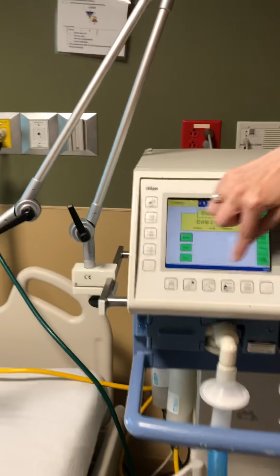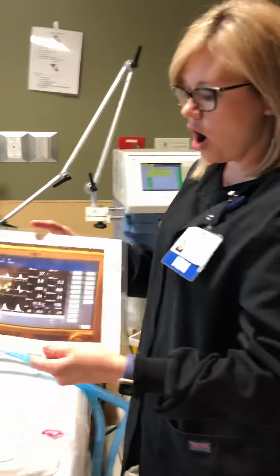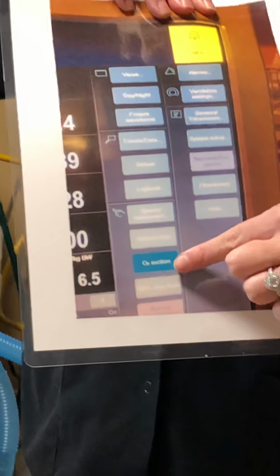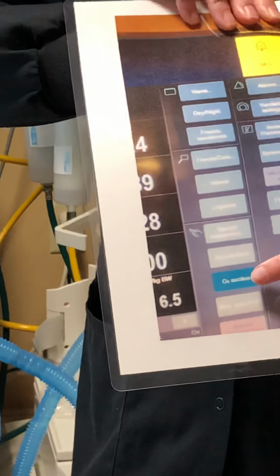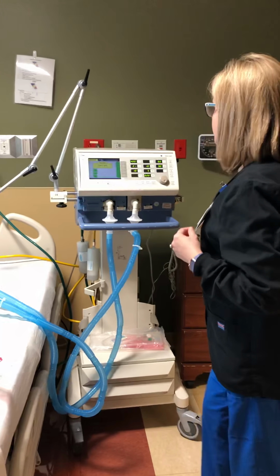And it will show on the ventilator that it's delivering 100% FiO2 or oxygen over a certain amount of time, usually 2 minutes. On the newer vents, it's on the left-hand side, and this is it blown up right here, okay? So just hit that button to deliver 100% oxygen. And at that point, you've already called for help and you have somebody coming in there, okay?